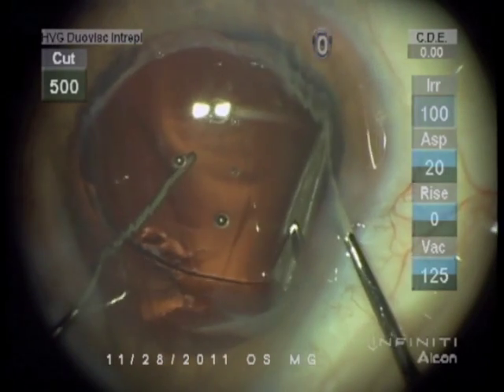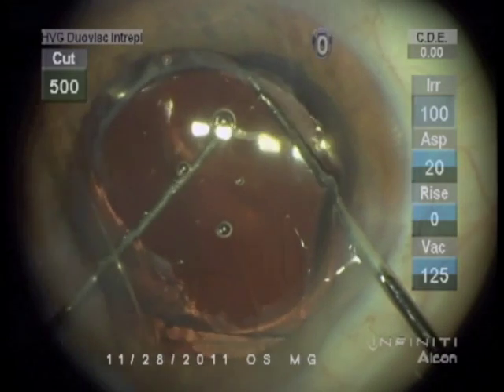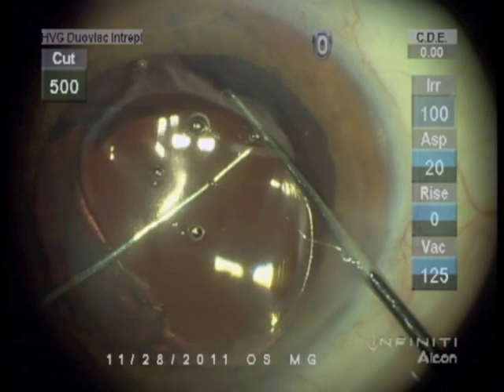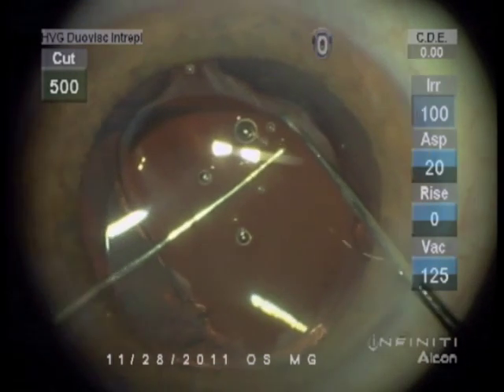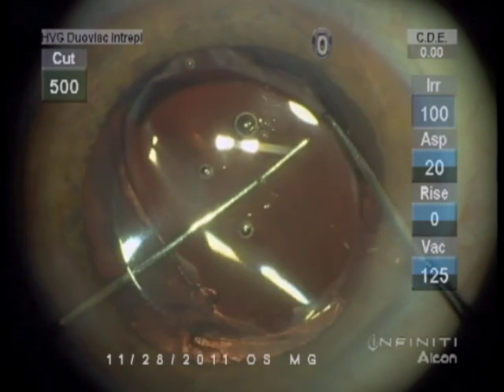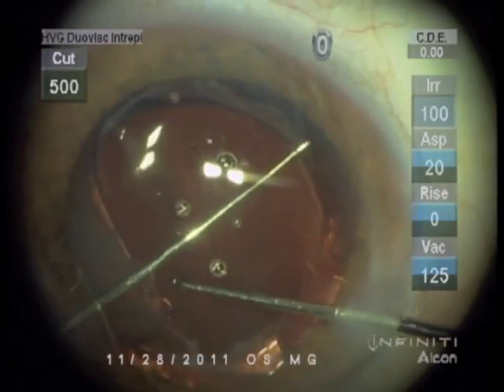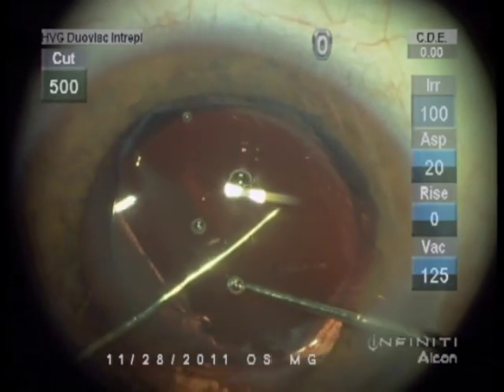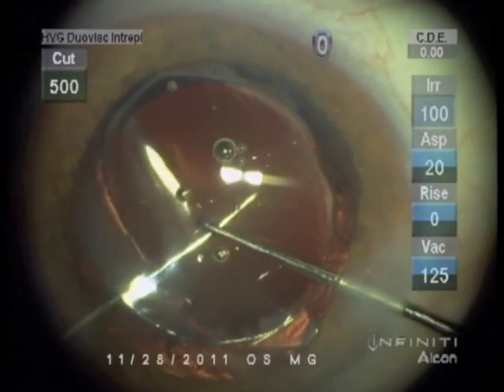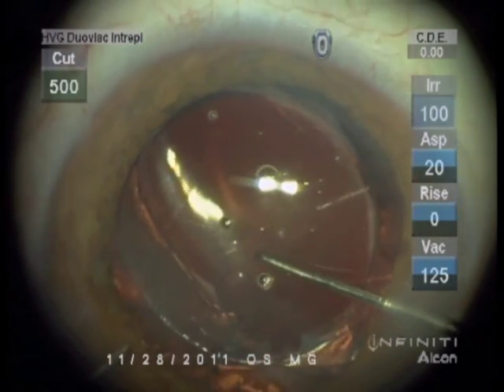She presented with two and a half diopters of against-the-rule astigmatism and 20/150 uncorrected vision. Now we're pulling the other side anterior to the capsule. That temporal haptic has remained in the capsule, but now we're using optic capture to center and stabilize the optic.